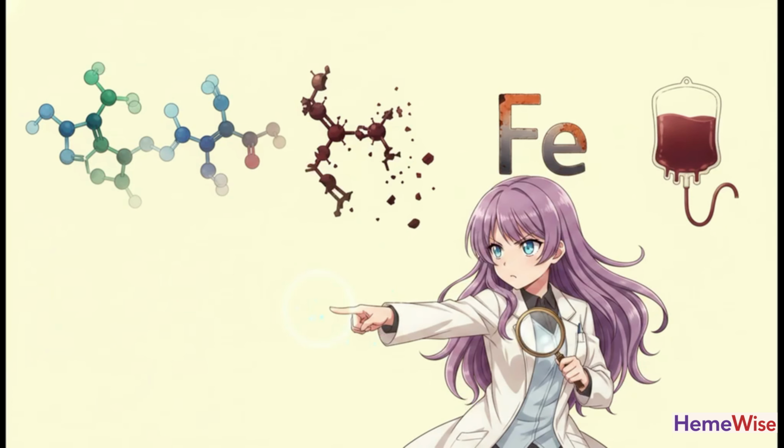Well, here are our prime suspects. First up, hemoglobin E can co-elute directly with hemoglobin A₂ on some HPLC platforms, totally masking the true value. Second, degraded fractions of hemoglobin S can sneak into that A₂ window, falsely elevating it. Third, and this is probably the most important one for everyday practice, a simple iron deficiency can modestly lower hemoglobin A₂. This can literally obscure a borderline beta-thalassemia trait entirely. And finally, if a patient just had a recent blood transfusion, those donor red blood cells are going to alter every single peak on your graph for months.